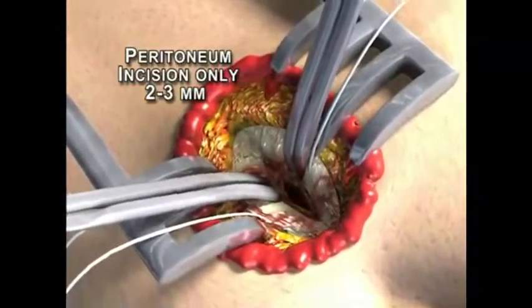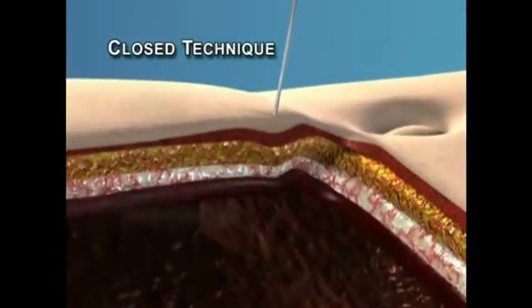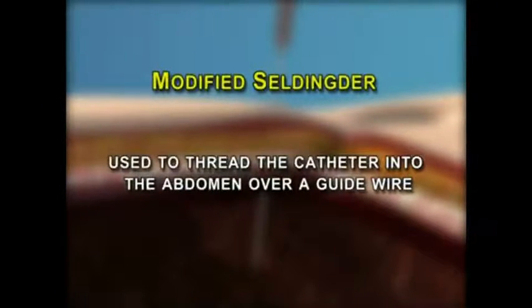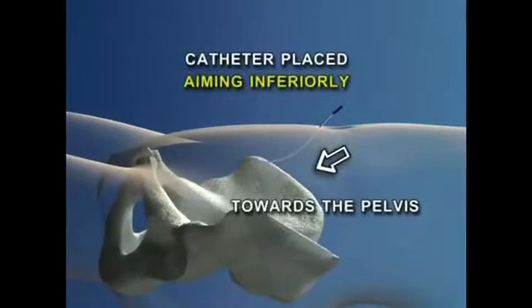Note: the closed technique uses an introducer needle to penetrate the 3 layers of skin, fascia, and the peritoneum. The modified Seldinger technique is then used to thread the catheter into the abdomen over the guide wire. The peritoneal lavage catheter is then placed into the abdomen, aiming inferiorly towards the pelvis.